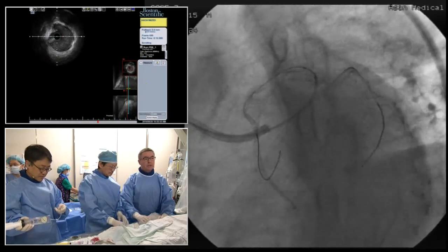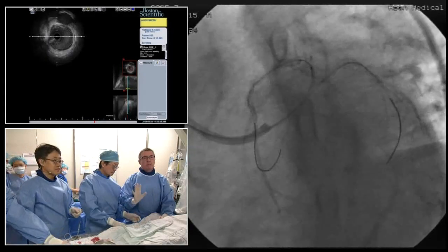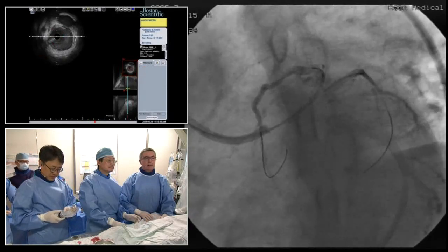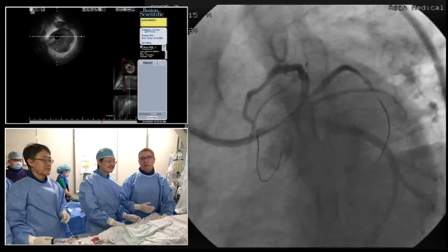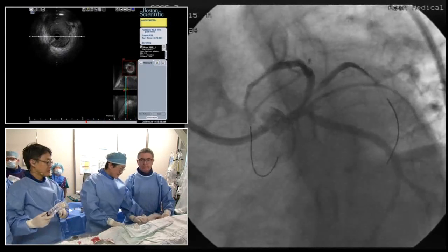So we're going to do a direct stenting technique. The plaque is pretty soft, only tiny little bits of speckled calcification there in the proximal LAD. So I think that a direct stent technique will work, and we're going to leave enough room to do a POT technique in the left main. And could I show you the circumflex?